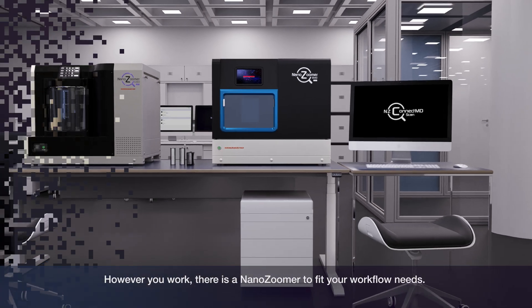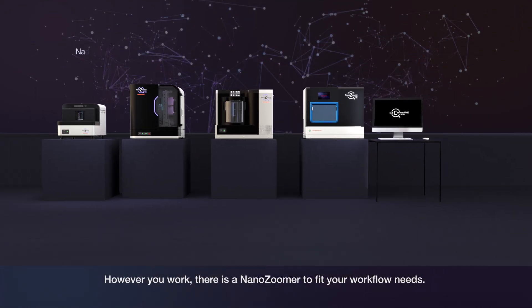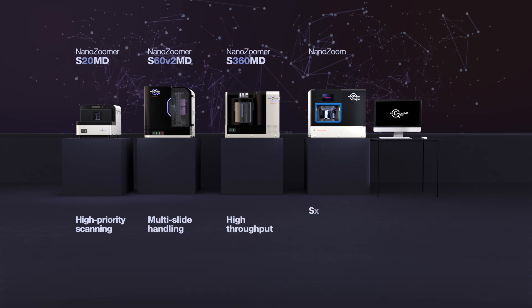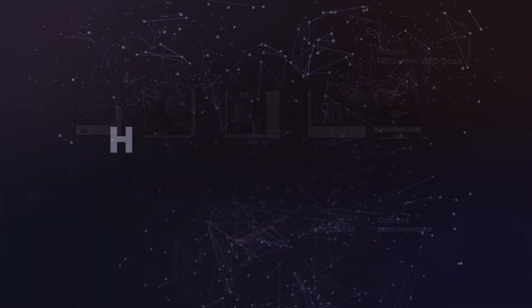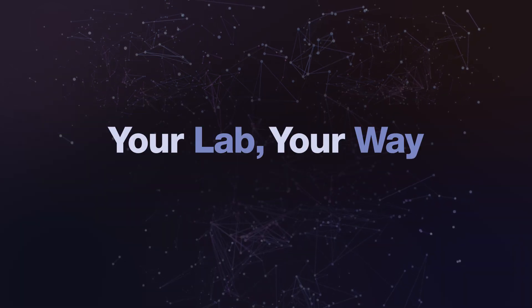However you work, there is a NanoZoomer to fit your workflow needs. Your lab, your way.